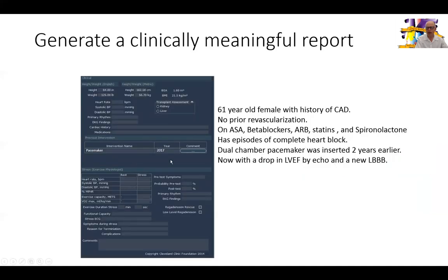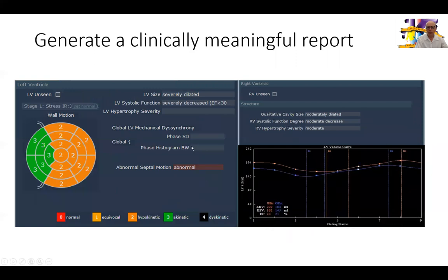We filled the form to indicate what is going on with this patient. Here are our findings: this is a lady with heart failure, a new left bundle branch block, on adequate medical therapy. We report the ejection fraction and wall motion — the septum was worse than the rest of the ventricle so we coded it accordingly. We call the ejection fraction severely reduced with severe dilation of the left ventricle, and we also noted that the RV was not contracting well, so we reported that too.